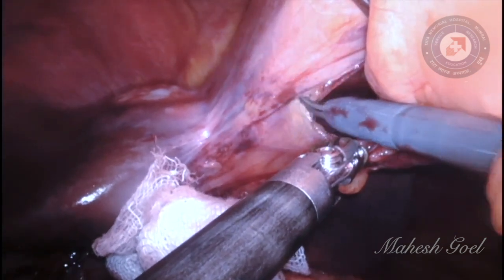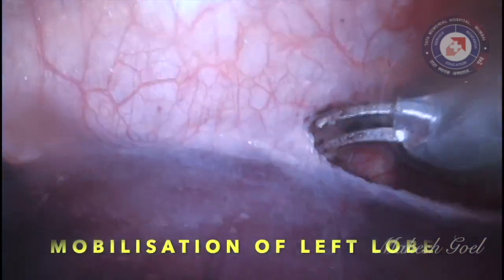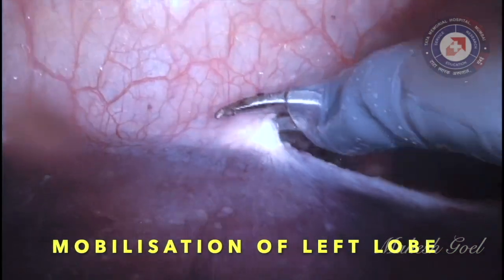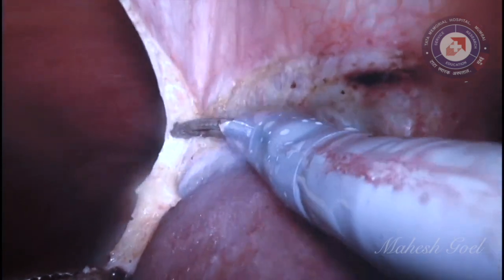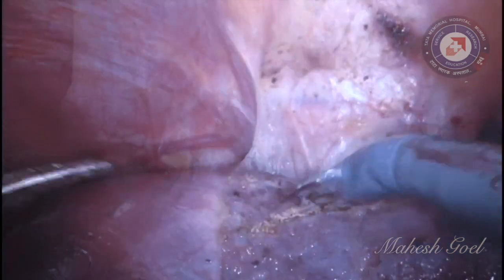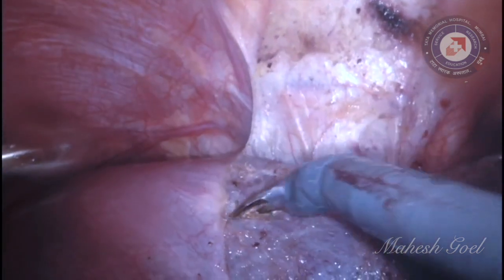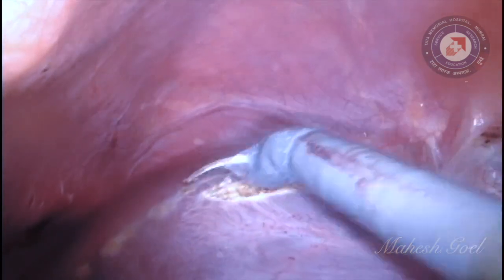Peritoneal attachments of the liver — including the falciform ligament and the left triangular ligament — are taken down. Complete mobilization of the left lobe of the liver entails division of the anterior and posterior folds of the left triangular ligament. Division proceeds until the left margin of the IVC is noted, at which point the posterior plane of transection is communicated with the anterior plane that has already been marked.